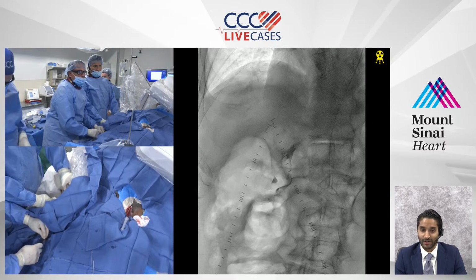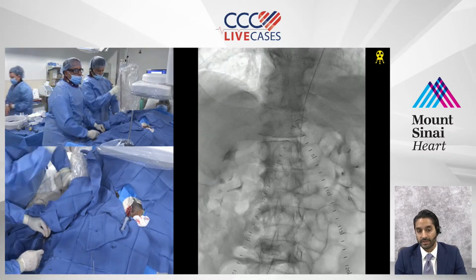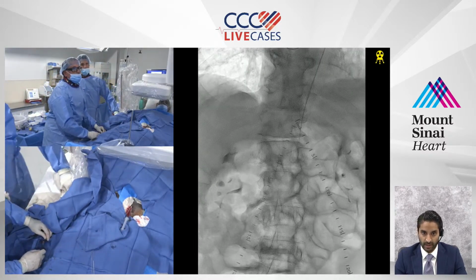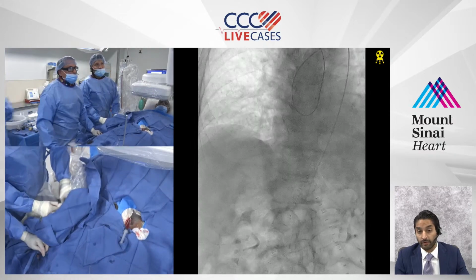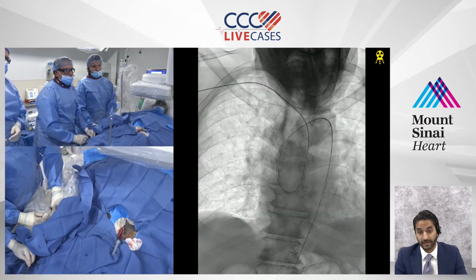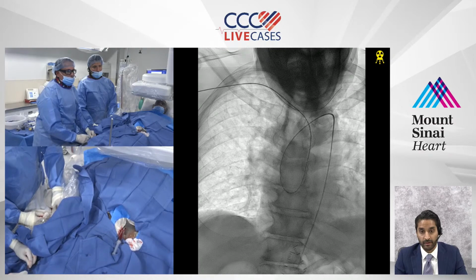It seems as though radial access is proving quite challenging. Whether proceeding for the femoral popliteal disease, as of right now, we haven't fully visualized what the infrapopliteal tibial vessels look like, would be to maybe decide whether a tibial first access, depending on this. Oh wow, that is a very impressive loop. It's a very challenging type 3 arch that we saw on the aortogram.